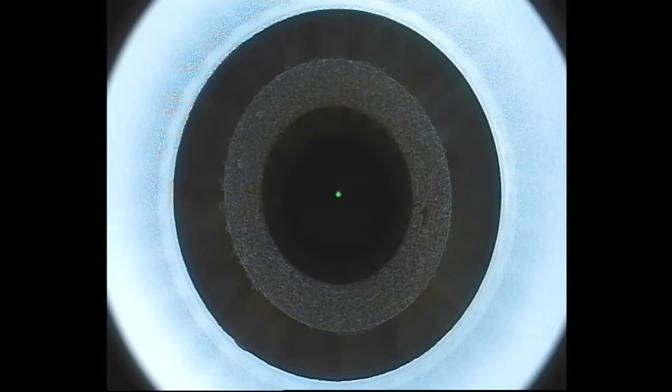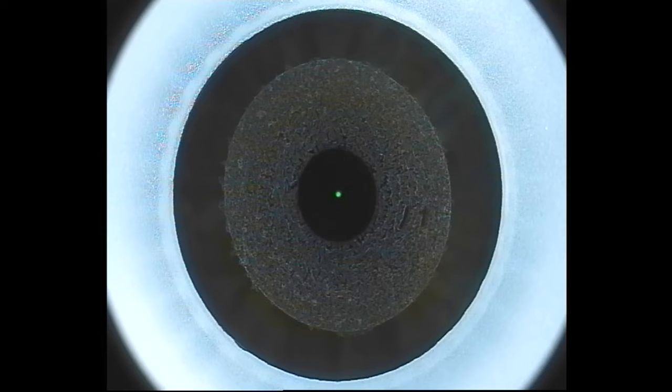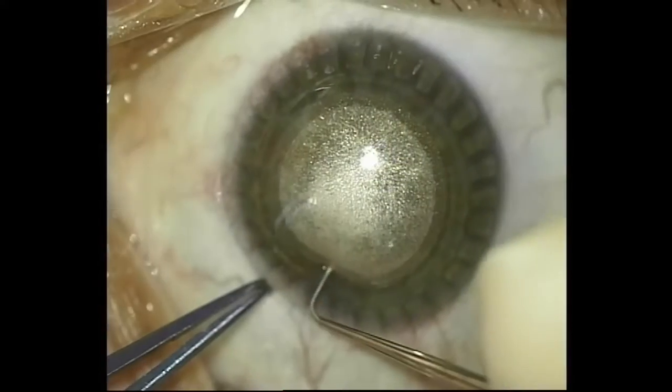I've pressed the foot pedal and the laser is now making the lenticule cuts. It first makes the posterior cut, which is the refractive cut, and then the anterior cut, also known as the cap cut. This whole process takes about 24 seconds — it's really quick. Now I'm making the side cut, which creates the tunnel to allow us access to the lenticule. And that's it — the laser has done its job.